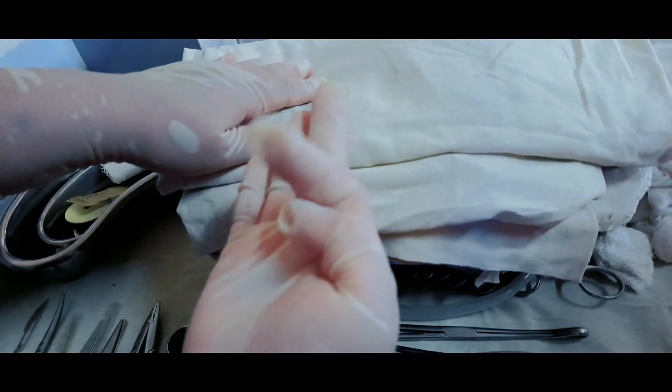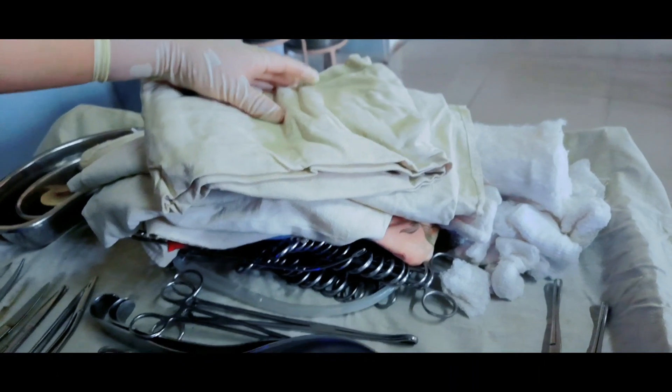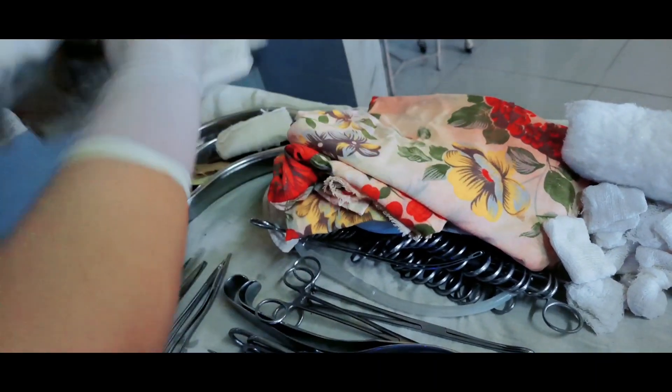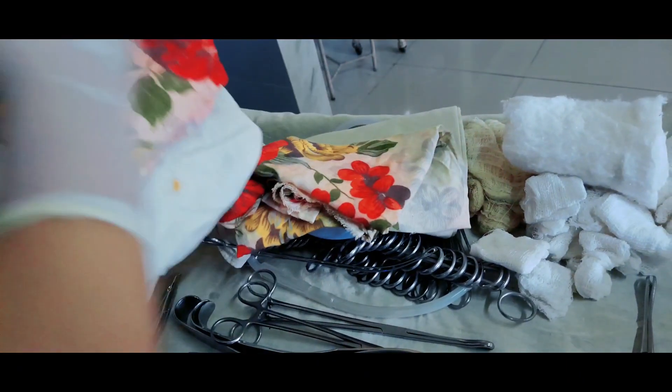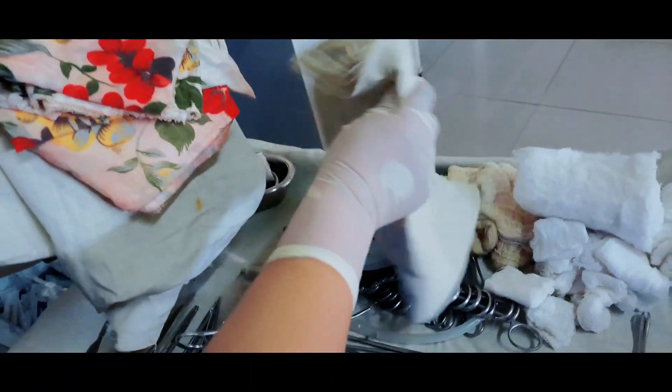Here I have taken five towels — three big size and two small size — to drape and completely cover the patient.